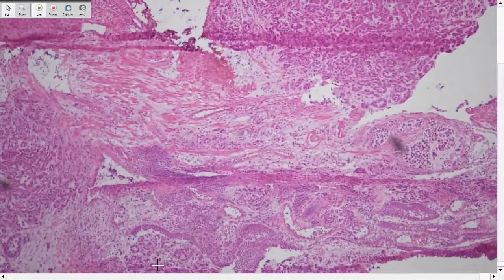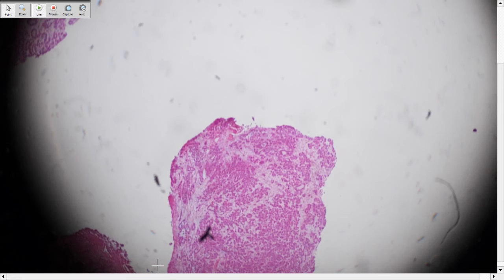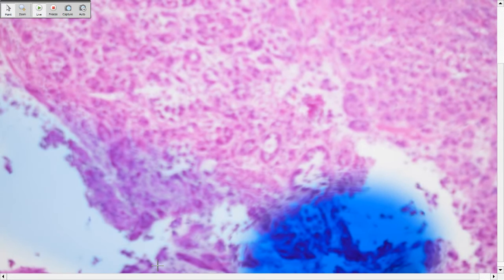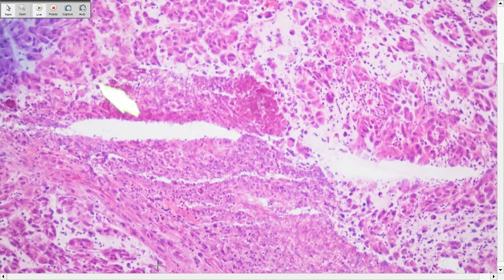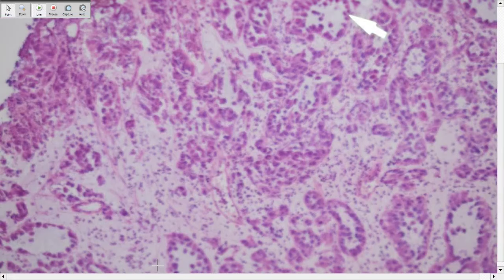Male, female, right? Female. At that time there was no imaging information. They didn't tell us how big the mass is. This was diagnosed at Queens. So the frozen, I thought somewhere here, looks like a tumor. How do you call this frozen? Maybe we just call it positive for malignancy.